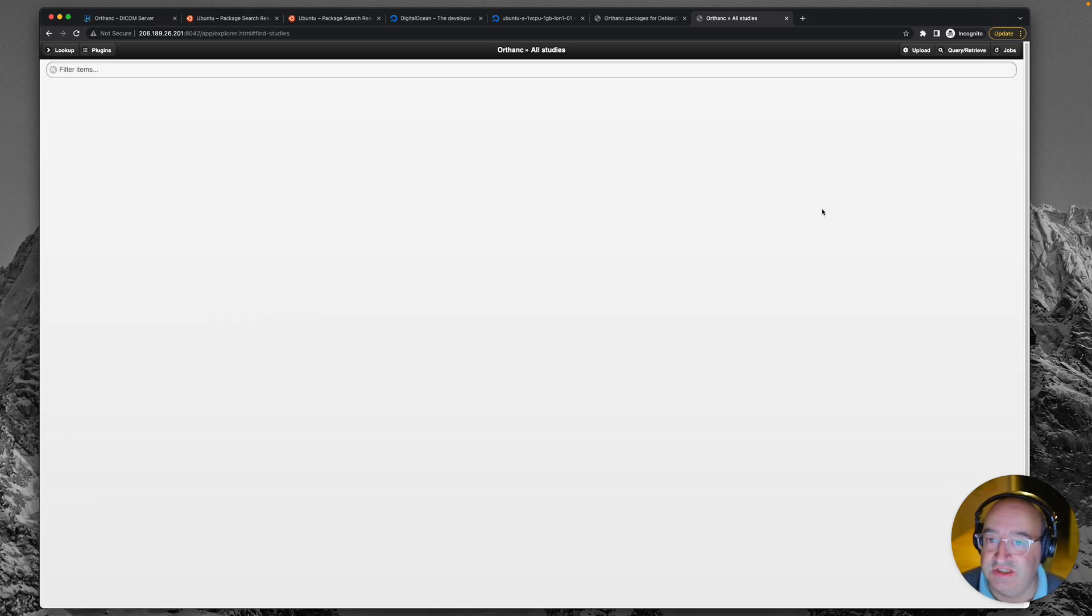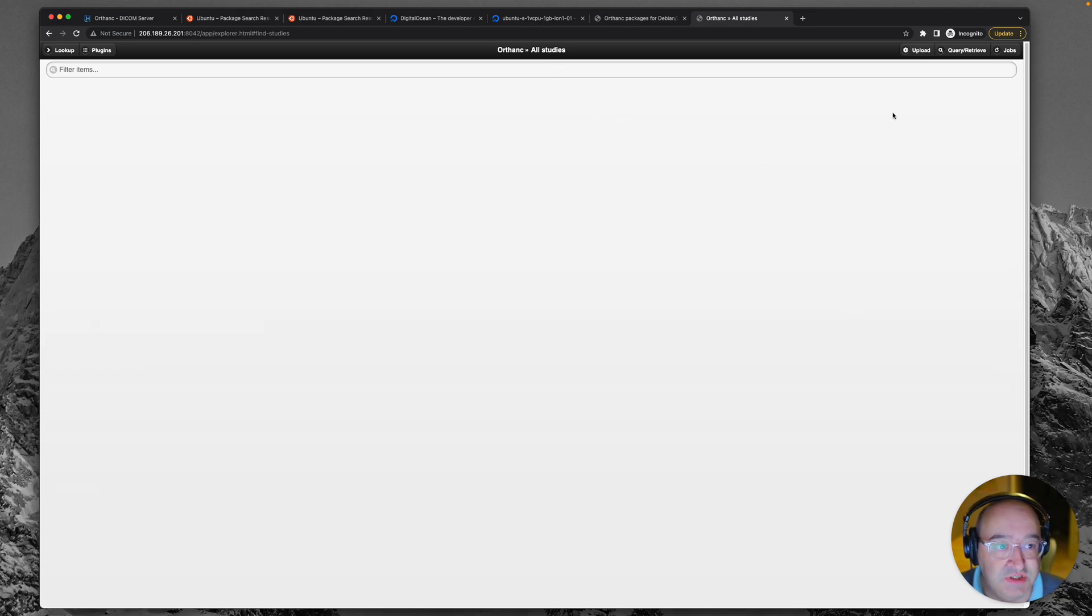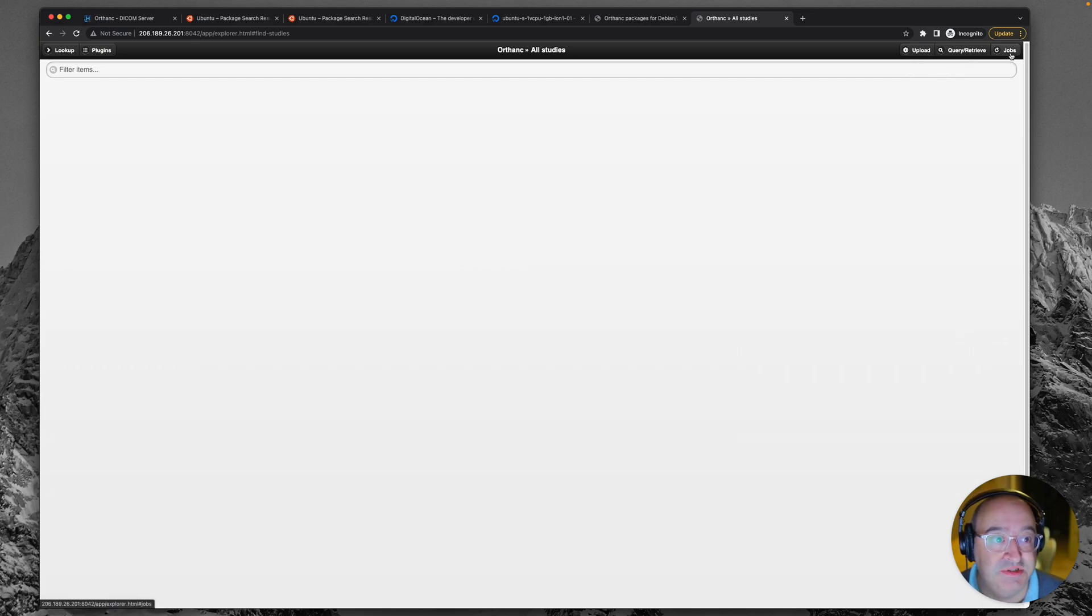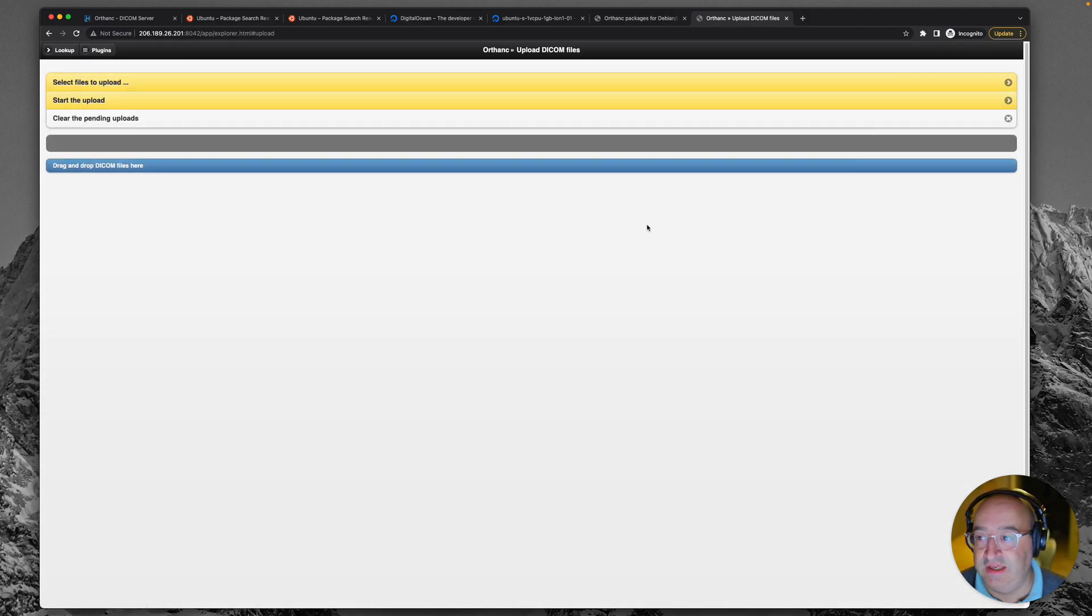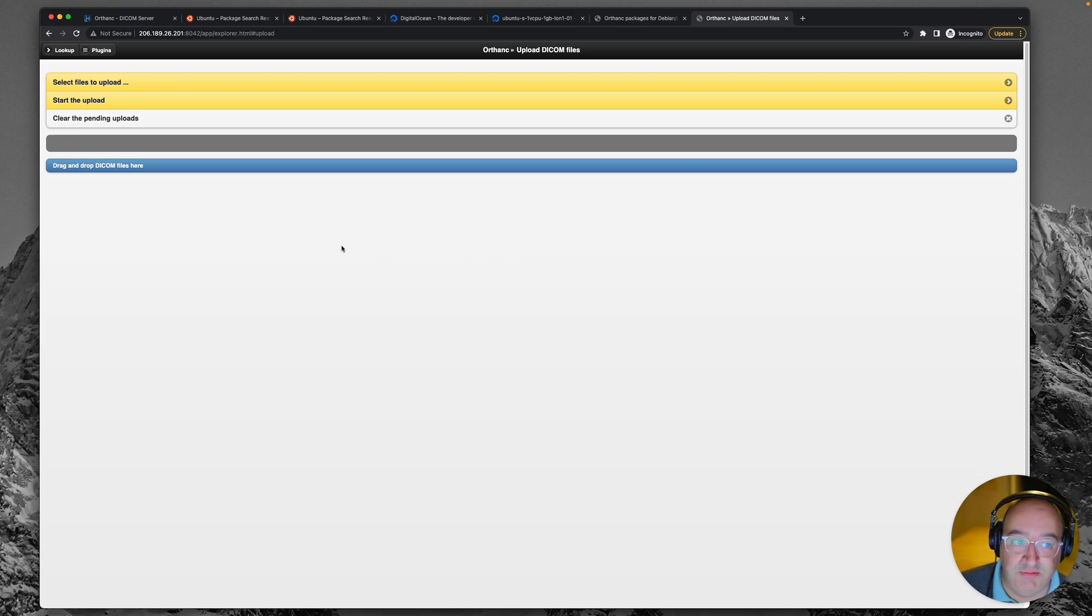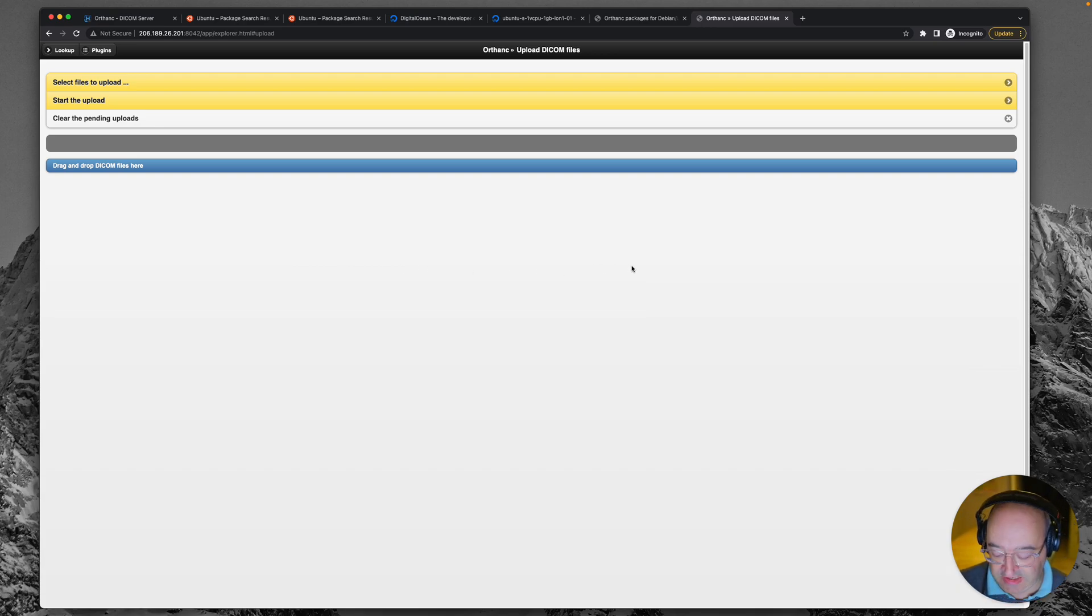So I guess the next thing we need to do is try and get some images on here. And you'll notice on this screen, which is the all studies screen, there is that there are a number of options in the top right corner. So we've got upload query and retrieve and jobs. So upload is just what it sounds like the ability to drag and drop some DICOM images here and send them up to the server. So that sounds really cool and straightforward. Let's give that a go.